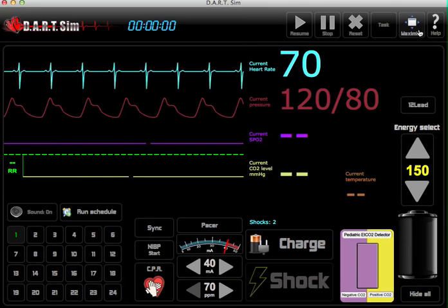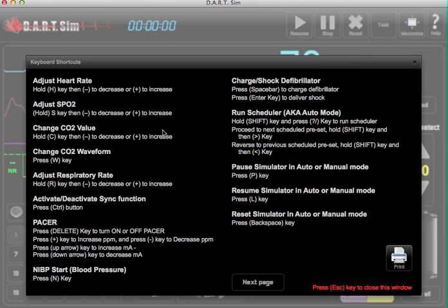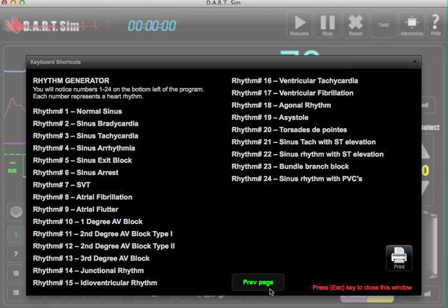We also have a help button here so if you want to print out all the functions for the keyboard and have that as a shortcut, you can also print out the rhythm generator key as well.